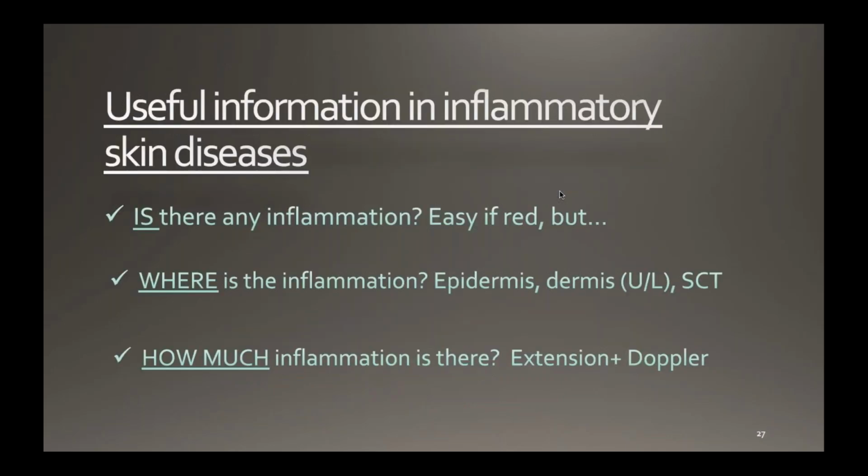And to make a resume regarding these inflammatory skin diseases, we can assess with ultrasound if there is inflammation. That is easy, when it's red. But some inflammatory diseases, as the deep inflammatory diseases, are not so easily evaluated as the more superficial. Where's the inflammation?